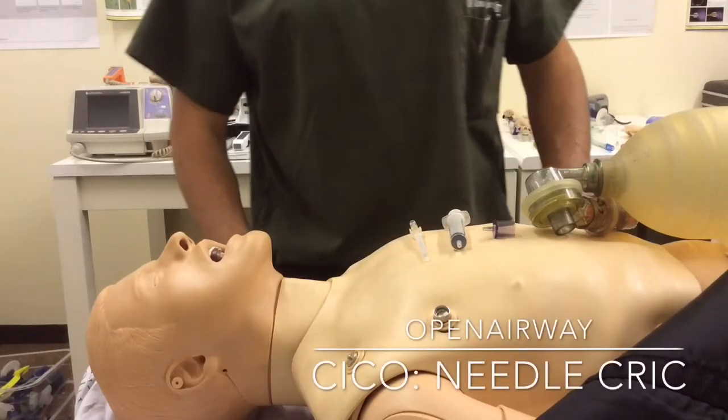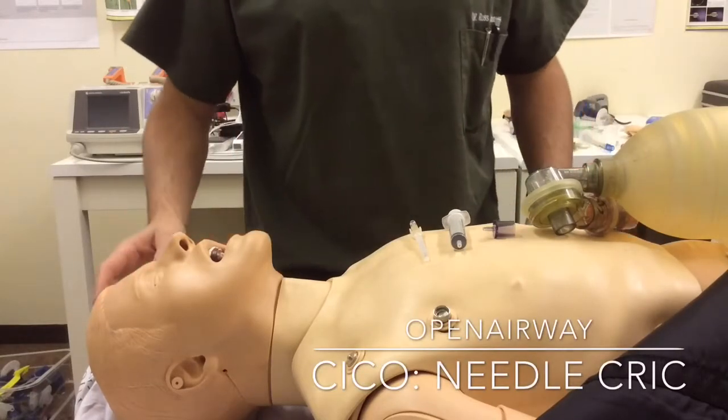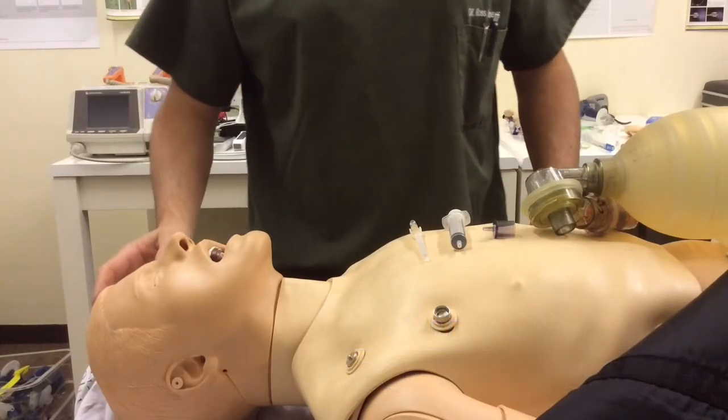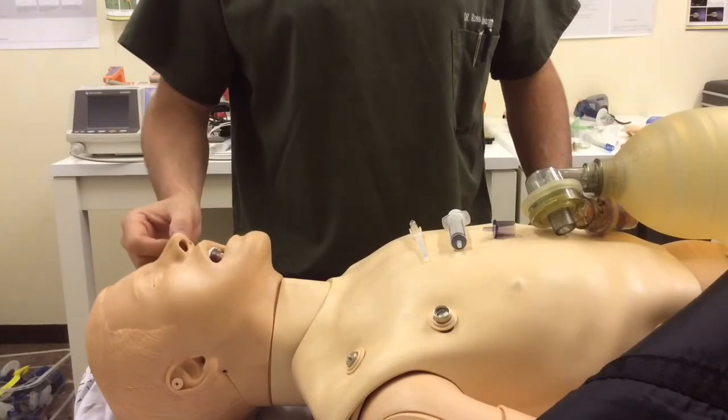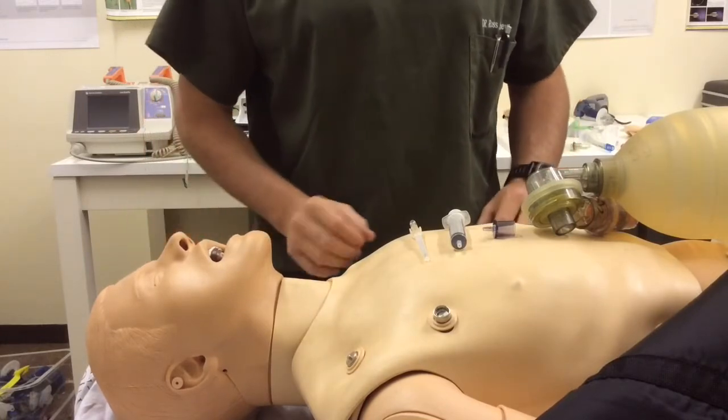Hey there folks, Ross here from Open Airway, currently in the UCT Anesthesia Airway Skills Lab, and I just want to respond to Min's excellent short video just now on some finer points of technique for the cannula cricothyroidotomy.